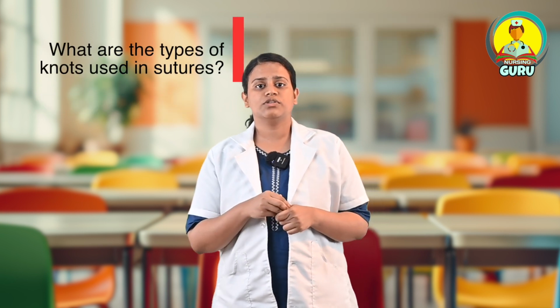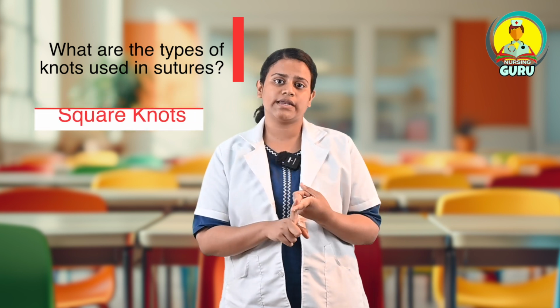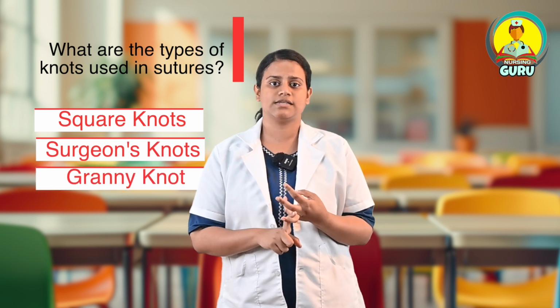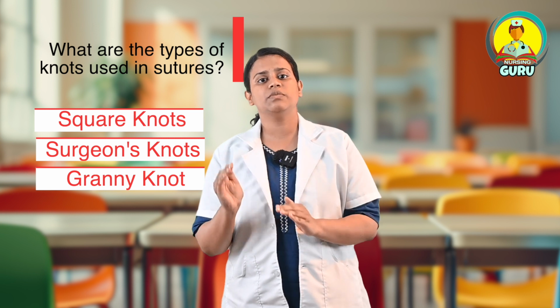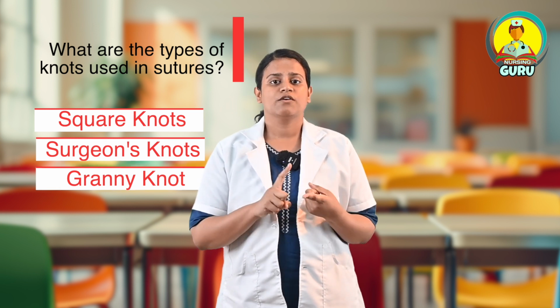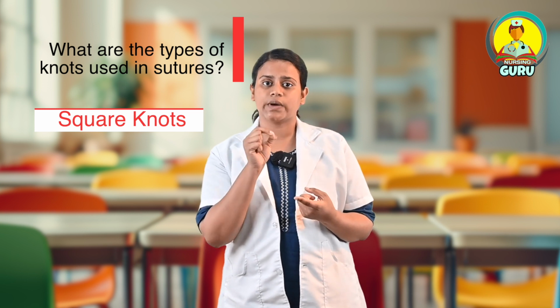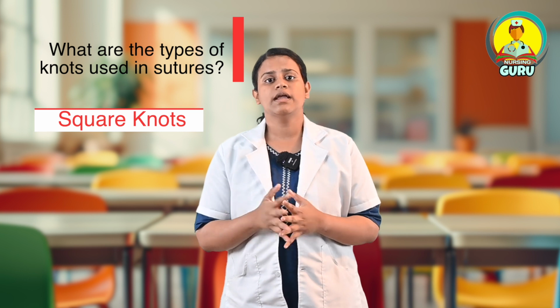Then we will discuss the types of knots. There are three different types of knots. One is secure or square knots. Second one, the surgeon's knot. Third one, the granny knot. It is very easy to understand, as the meaning of the knots is there in the name. First one, secure or square knot: the knot tied in a square manner or in a secured manner is known as a secure or square knot.